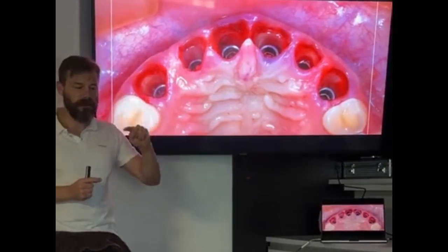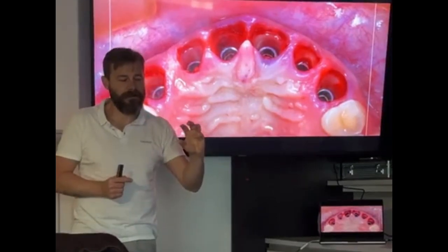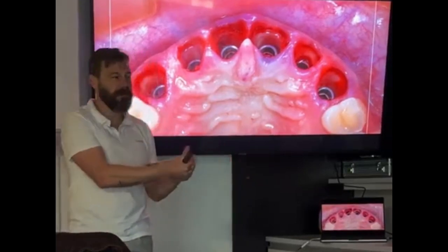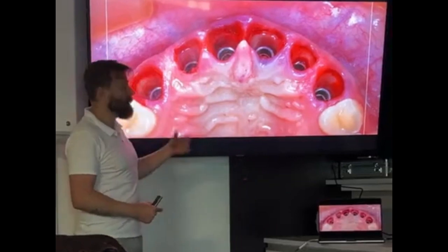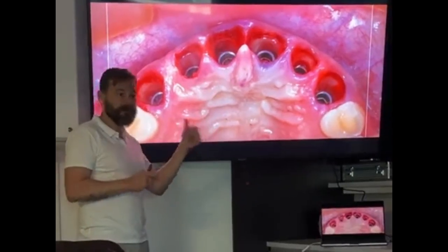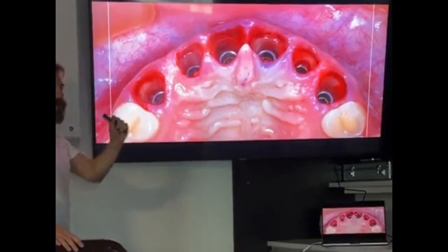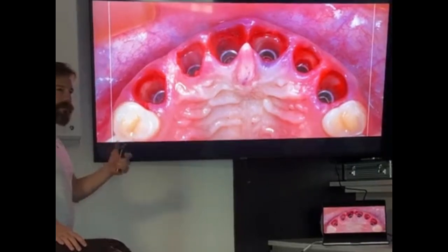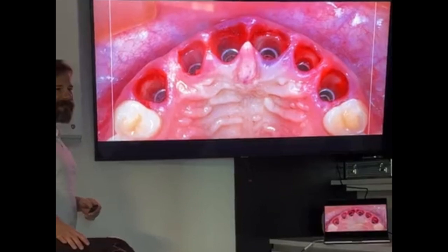Then I'm going to need some maneuver or some technique to promote this stabilization. I can use a membrane, I can use a bone plate, I can use RDI technique. There are many other things. You're going to discuss that in this sequence, right? But the key question is: is it stable? Yes. It's not moving? Yes. I can protect it? Yes. So be happy and don't worry about this, okay?